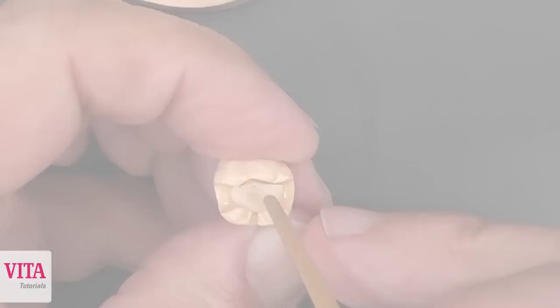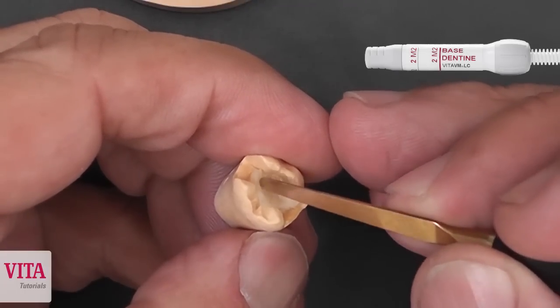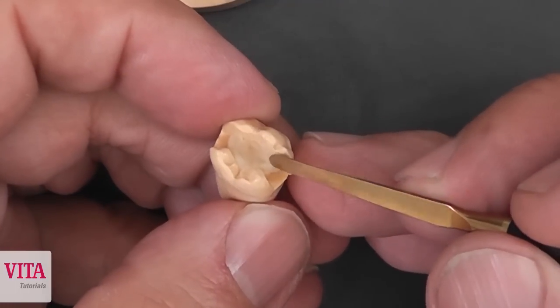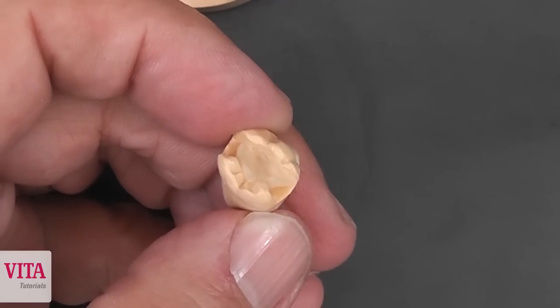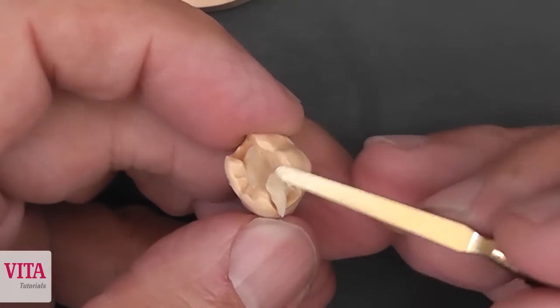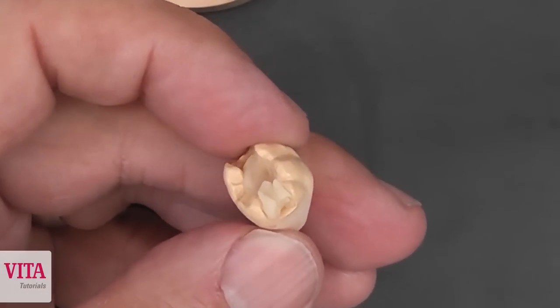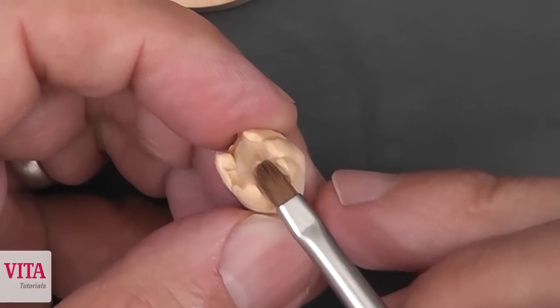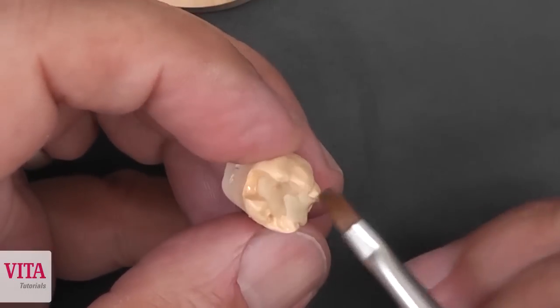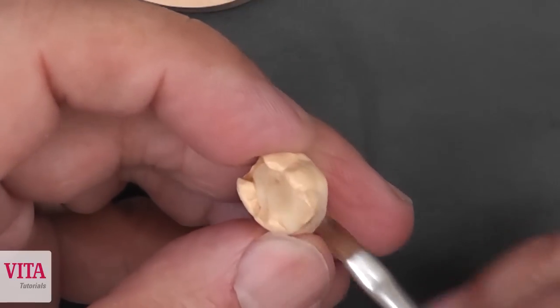The next step is the appliance of the base dentine. I use first my metal instrument to layer this material and then I try to soften it with my brush. Here you can see that I prepare all my occlusal elements so that I don't have to grind so much when I finish my inlay modulation, because a ground occlusion field never looks as natural as a modulated occlusion field.